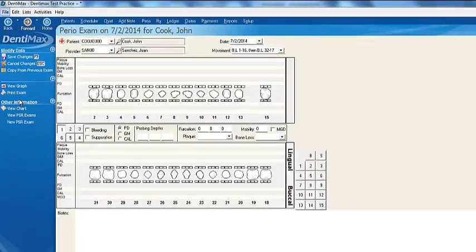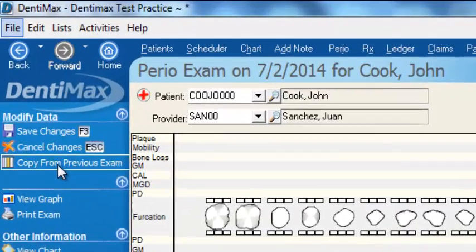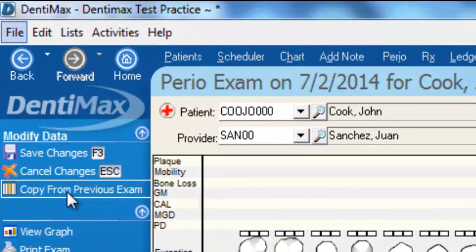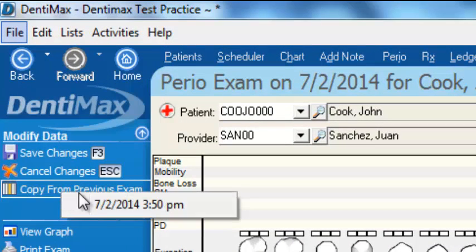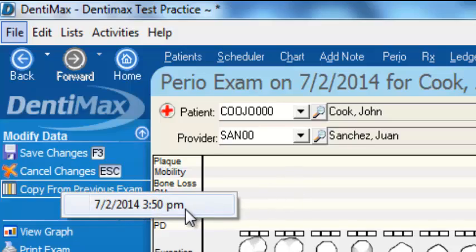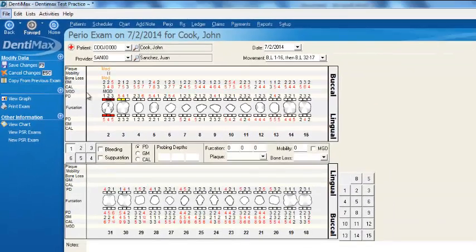We'll click on new perio exam. One of the things you can do is copy from a previous exam. If you click on that button, it will list all your previous exams. In this case, John Cook only has one previous exam, so when I click on that, those measurements automatically pop in.